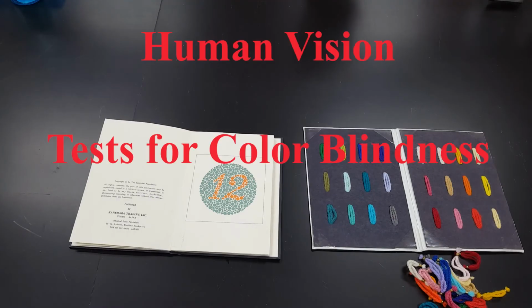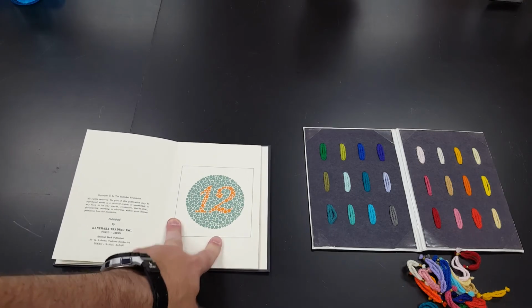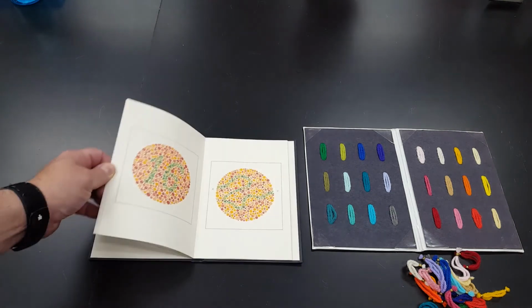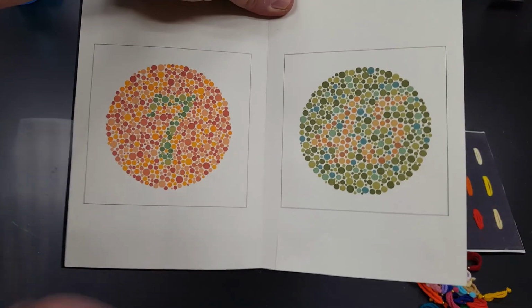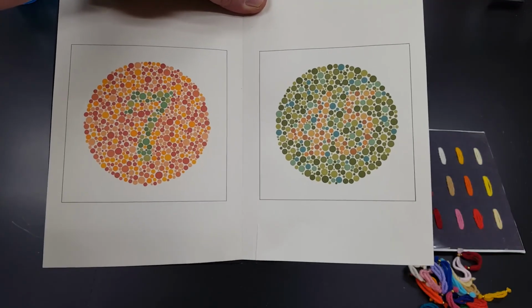Okay, also in this last lab for us of the semester, we do have to know how to test for a few things. So firstly, how is it that you test for color blindness? Probably the way many of you are familiar with is this methodology. These are called Ishihara color plates. And what you have a person do is look at these and read what numbers, if any, they see. For example, on the left-hand side, this one has a number 7 in it. On the right-hand side, this one has a number 45 in it.